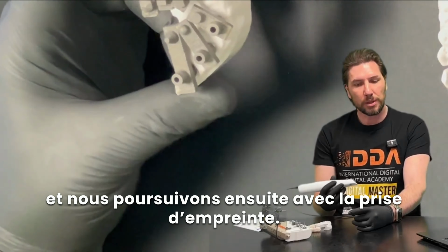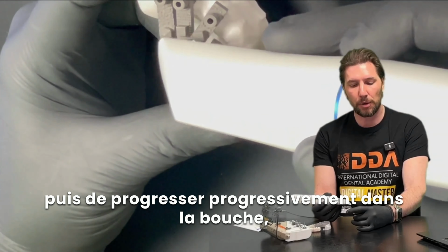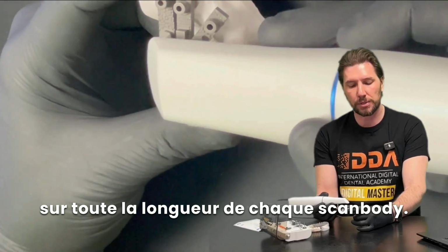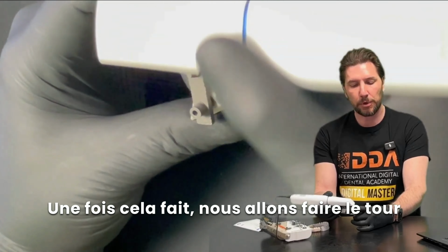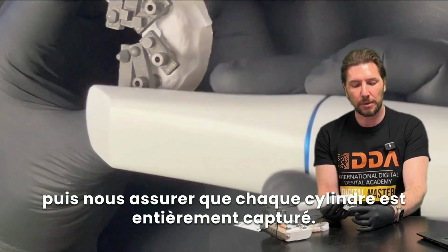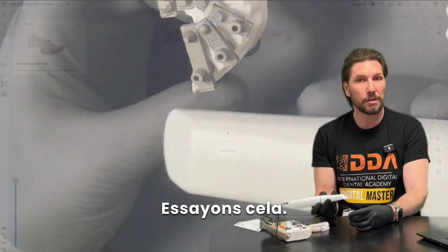As we go on with the pad, the main thing is we want to start off picking up these shapes and moving around the mouth, before then fanning back out along the stretch of each of those scan bodies. Once we've done that, then we're going to roll around and pick up the edge of the soft tissues before finally making sure that each one of these cylinders is completely captured. So let's try that out, okay?